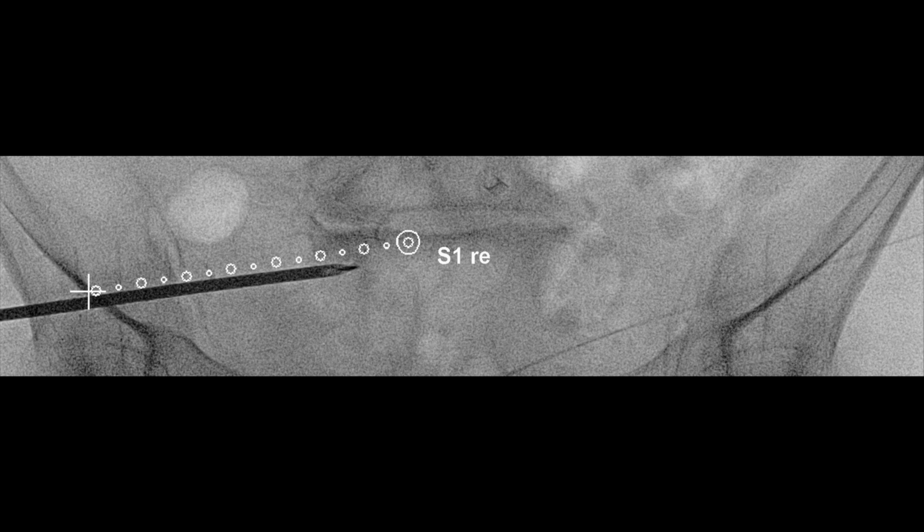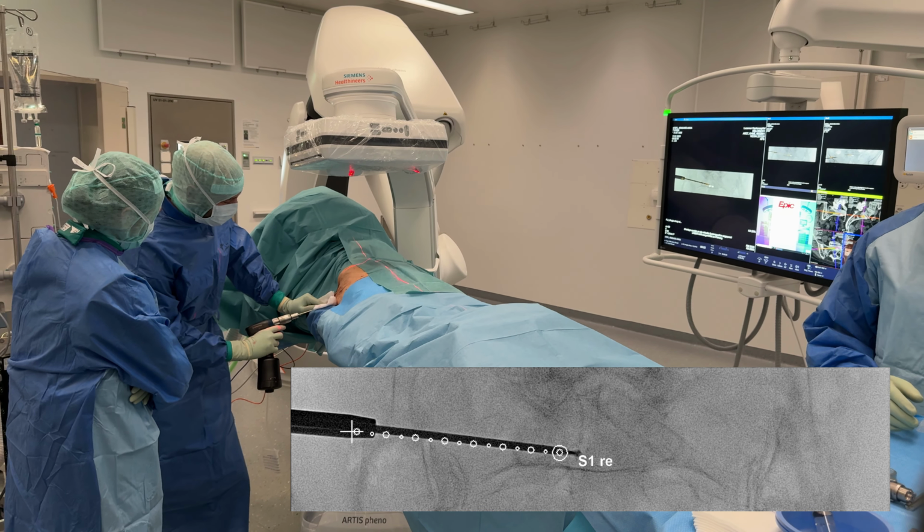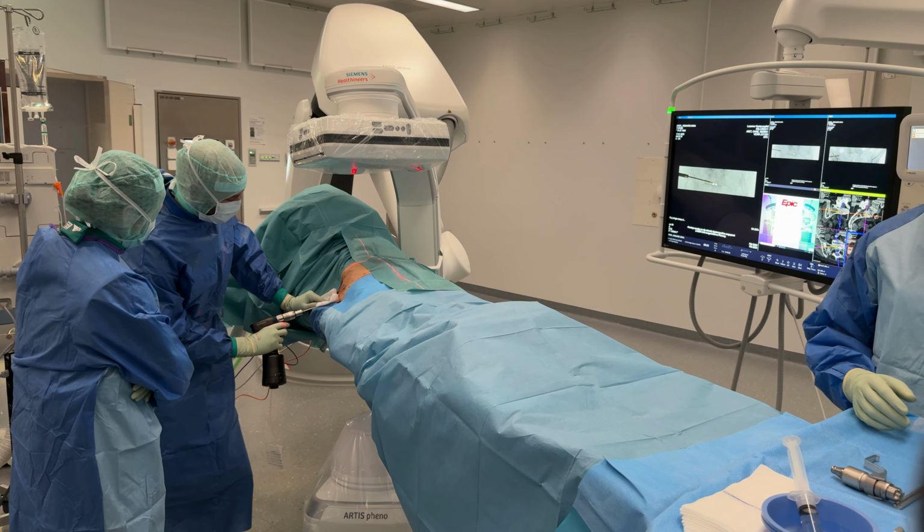Then the K-wire is further advanced on the repeated X-rays in both inlet and outlet views to control for correct positioning. Once final position is achieved, screw length is measured, and the three cortices are drilled and the screws introduced.